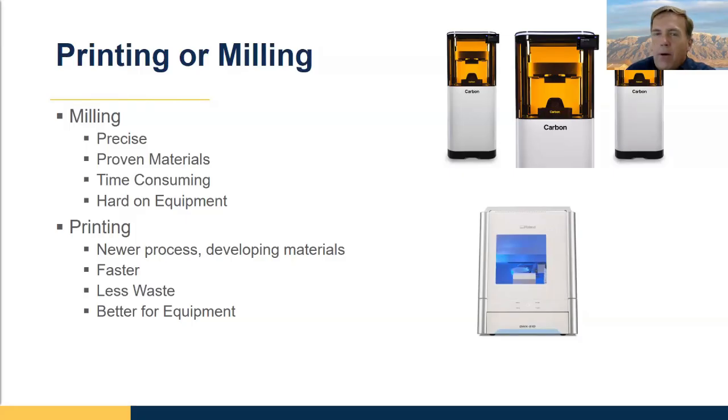So when digital dentures first came out, the first generation of printed materials were not awesome. And that really has been the limiting step. It hasn't really been the equipment. It's been the materials that we can load in the equipment. So a lot of those materials weren't that strong. They were kind of brittle and also prone to staining. For those of you who used them, you're like, this stinks. But the second generation, like we talked about, has really improved.